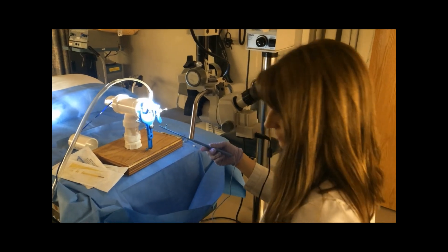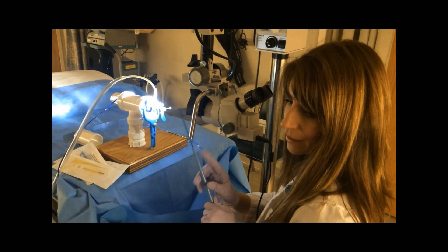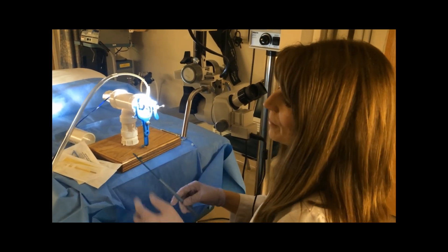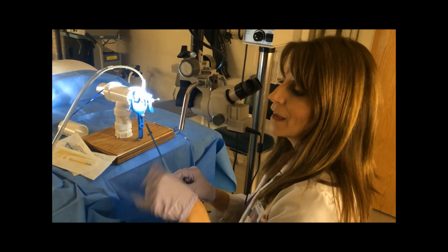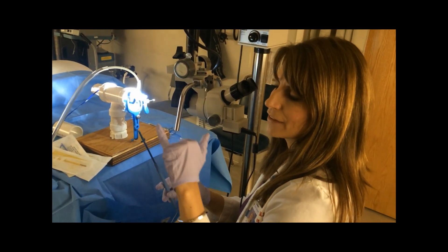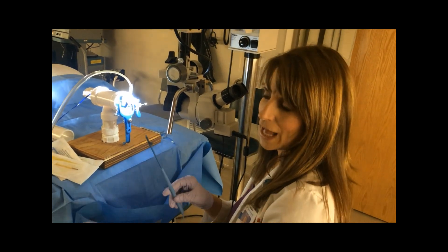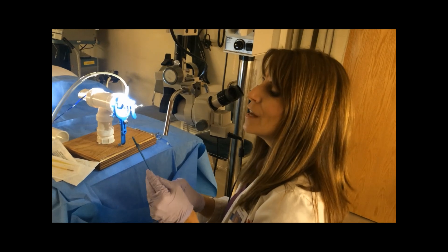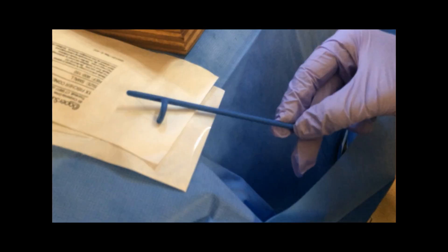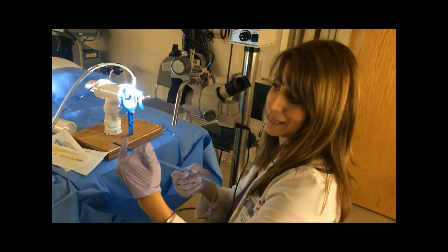I tell my nurse to turn the LEEP machine to live so that we can do cuts. Remember that this is not a cheese slicer — this is actually a wire that the electricity courses through, and it heats up the water in the cervix, and that's what actually makes the cut. You'll notice that this has a bar on it and you want to bury this in the woman's cervix all the way to that bar.